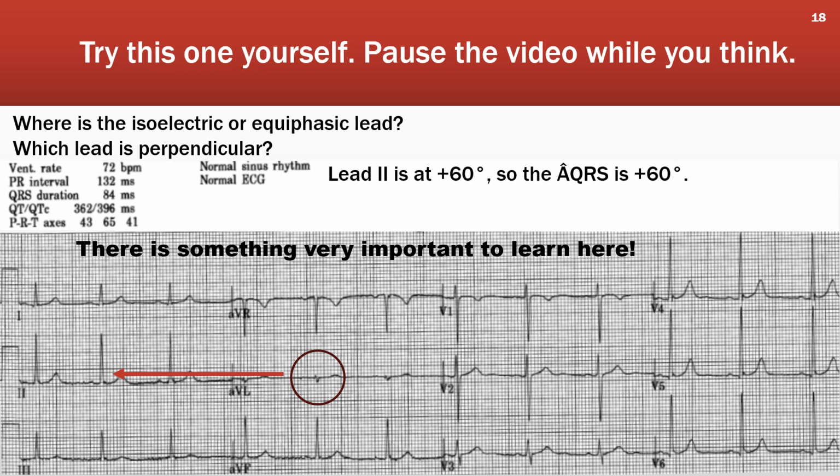So when the lead 2 axis is acting as the mean QRS axis in the frontal plane, look what it does to lead AVL. Look at the QRS complex in lead AVL. It's almost indecipherable. It's extremely small. It's the closest thing we've seen to an isoelectric complex. Okay, imagine a little bit of ST elevation in lead AVL. Do you think you would notice that?